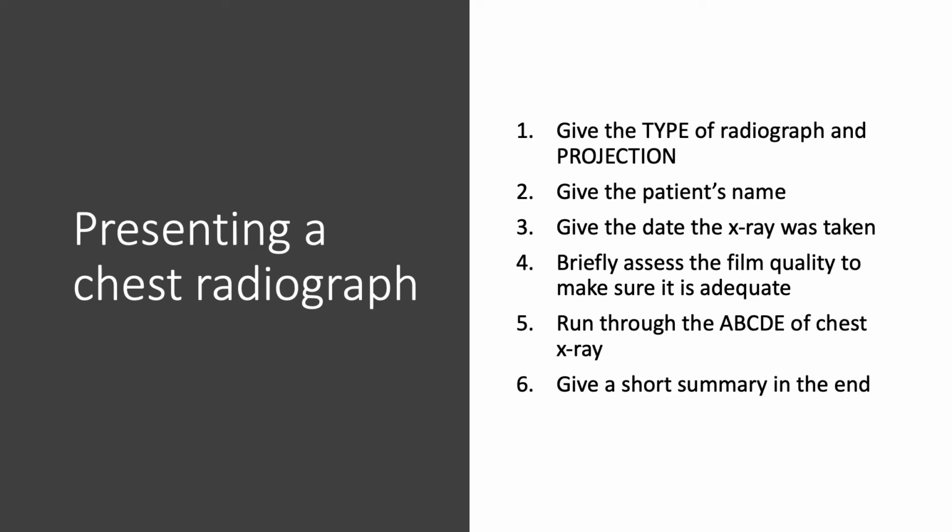Number 2, give the patient's name. Example, this is a PA chest radiograph of Juan de la Cruz. Number 3, give the date the X-ray was taken. Example, this is a PA chest radiograph of Juan de la Cruz taken on the first day of January 2020. Number 4, briefly assess the film quality to ensure it is adequate. Number 5, run through the ABCDE of chest X-rays. And number 6, give a short summary in the end. Number 4, 5, and 6 will be discussed in the next slides.